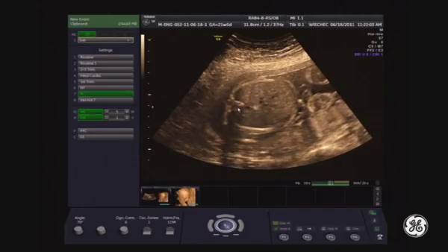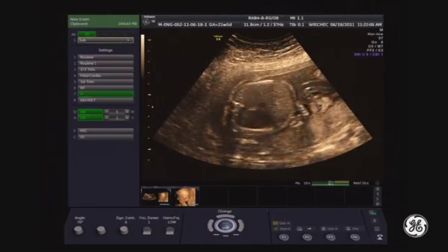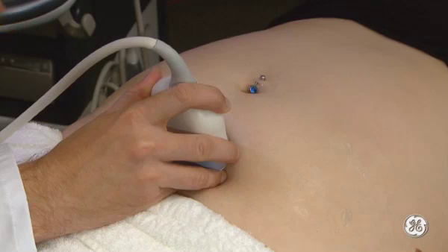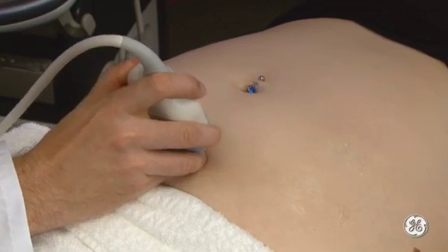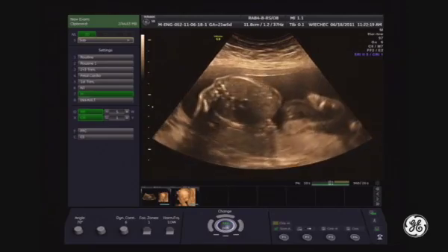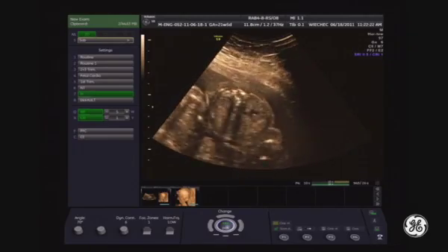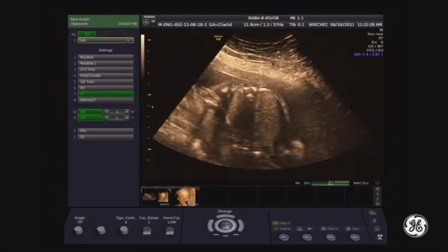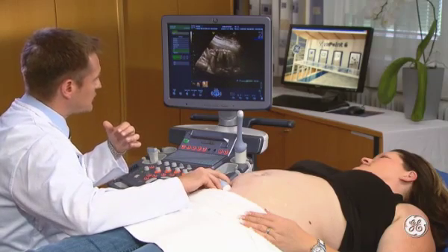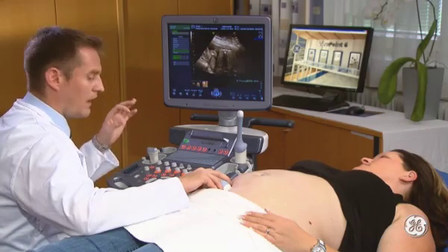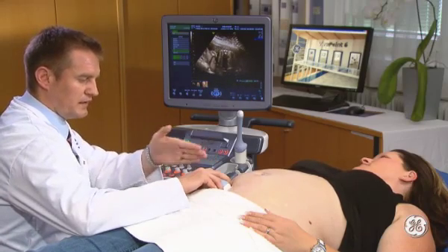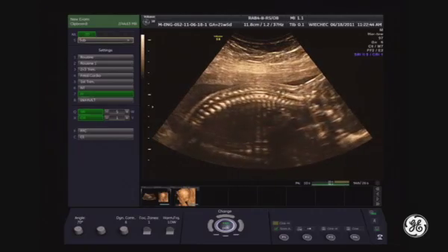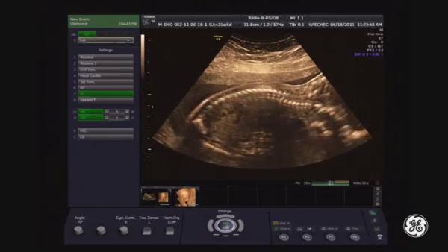The spine is at the nine o'clock position, so I will change the application point of my transducer to point directly to the spine. See my maneuver on the patient's belly — I'm bringing the spine exactly to the 12 o'clock position. This assures me that my rotation, which will bring me to the sagittal view of the spine, will be precise. I'll do the rotation now, turning the transducer 90 degrees — you can see it here.